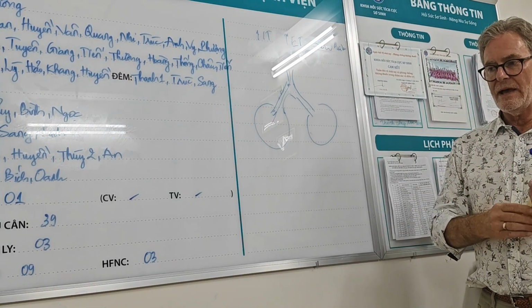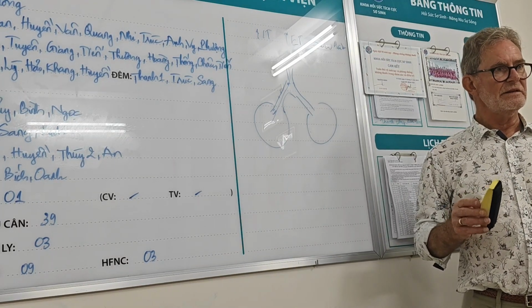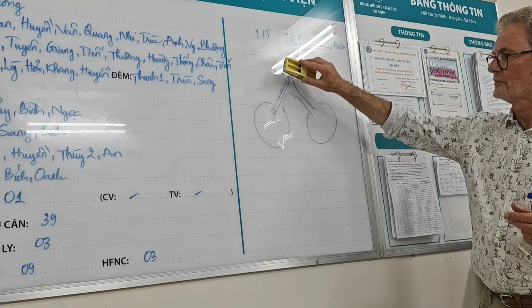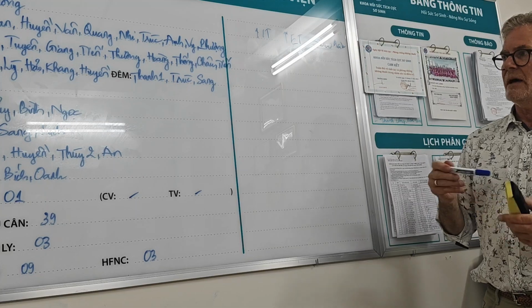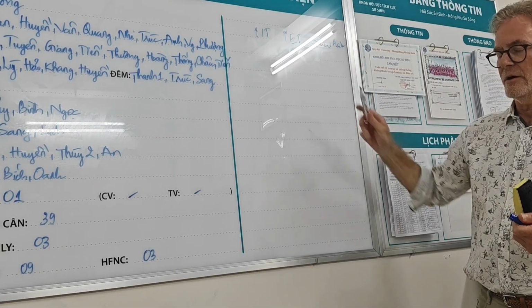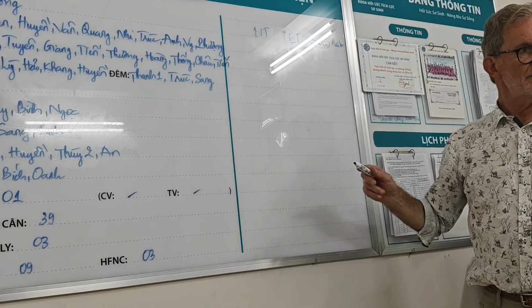And there is a way you can look at on your ventilator to see if that's happening. Basically what you're doing is you're looking at volume flow loops.